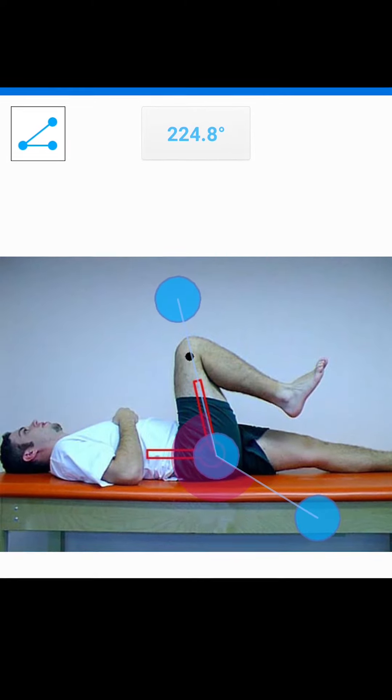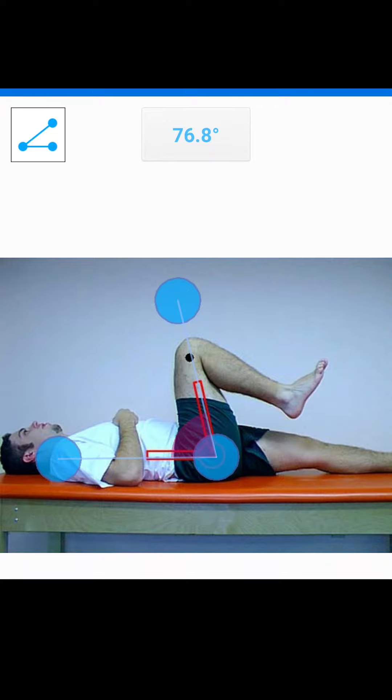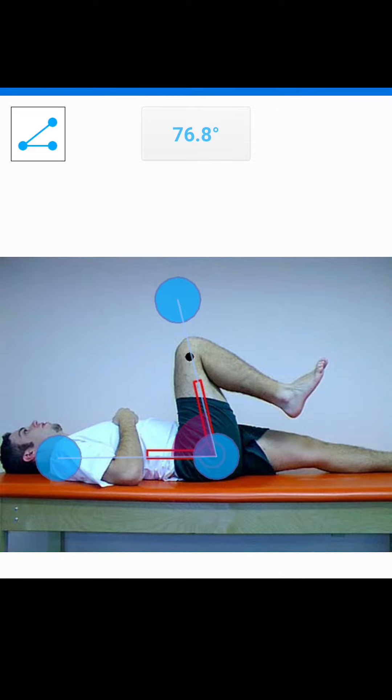So now I'm just going to switch and see what happens. Now you can see that it's measuring the angle between his thigh and his upper body. It says 76.8 degrees, but that also is not the correct measurement because that is not the range of motion that he has moved through — that is the range of motion that is left in that 180 degrees.